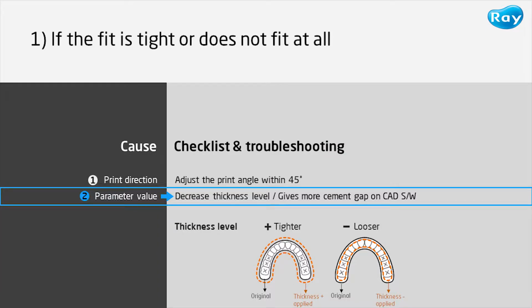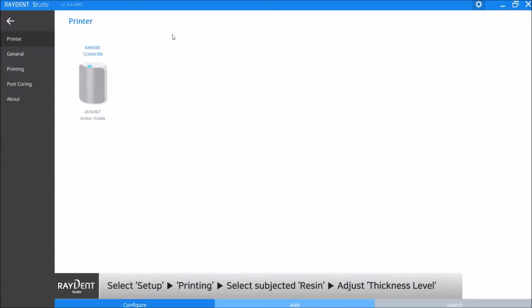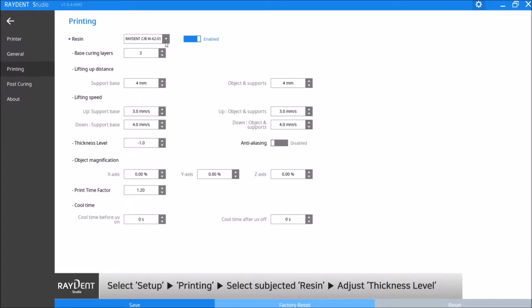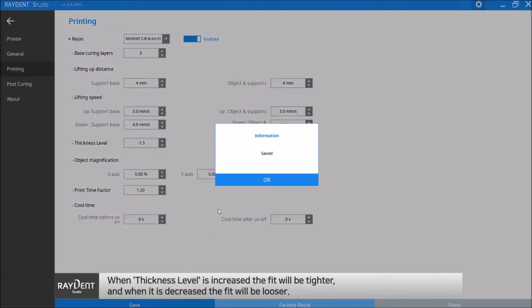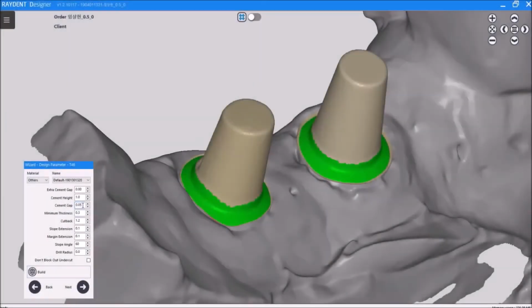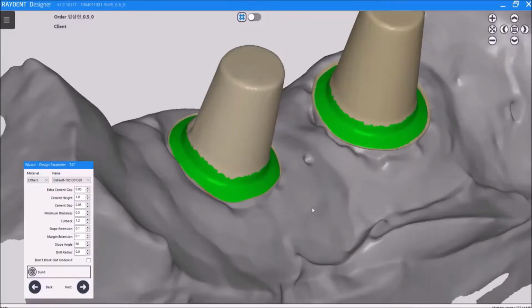If the printout is well seated but the inside is tight, there are two possible solutions. First, click on Setup in the upper right corner of the studio and click Printing in the left menu. And adjust the thickness level to have a more loosened fit by 0.5. Increasing the thickness level will make the print tighter, and decreasing the thickness level will make the print looser. Another way to make the print looser is increasing the cement gap in the CAD software.